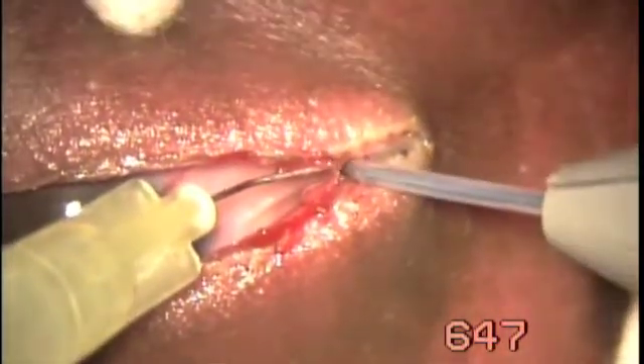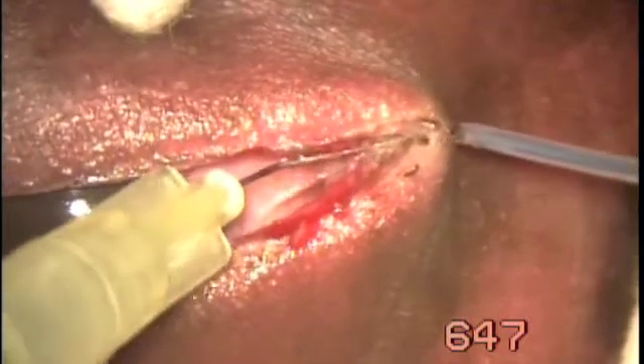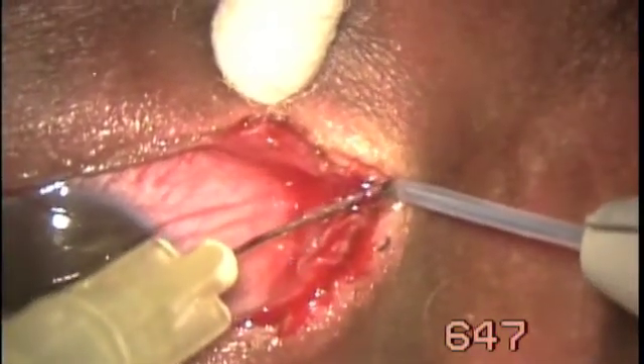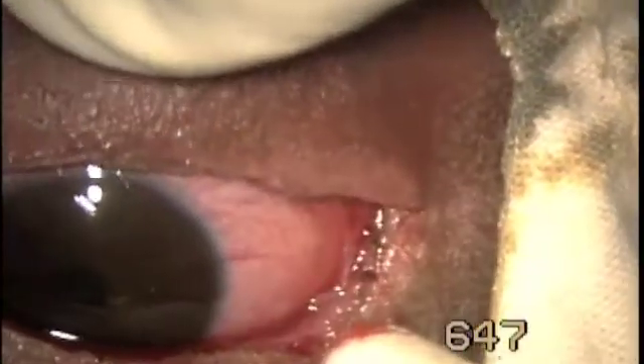The cutting mechanism. Both eyes were treated at the same setting.